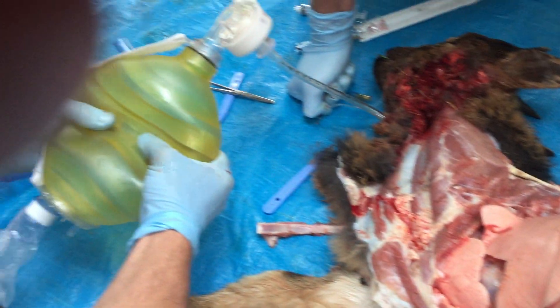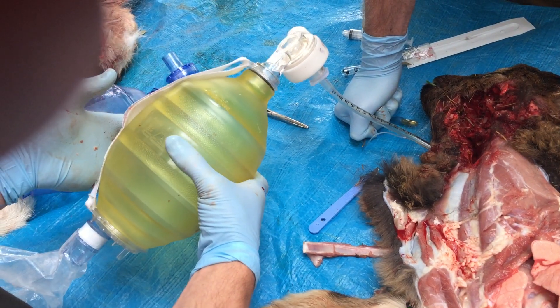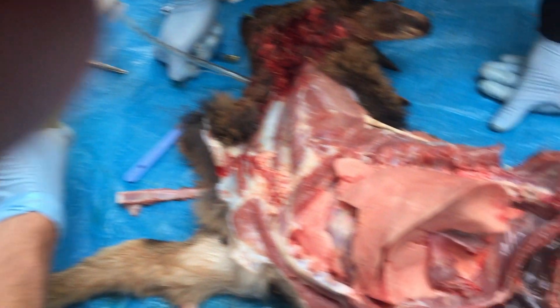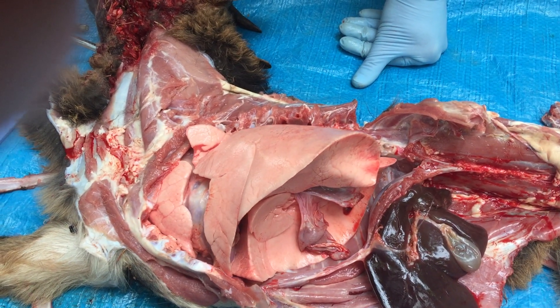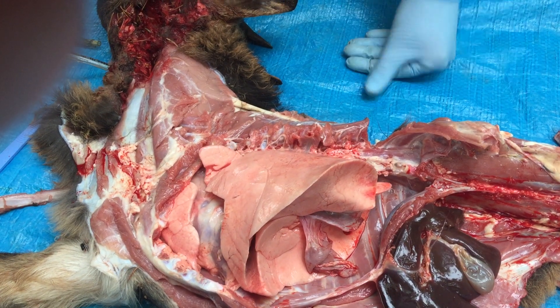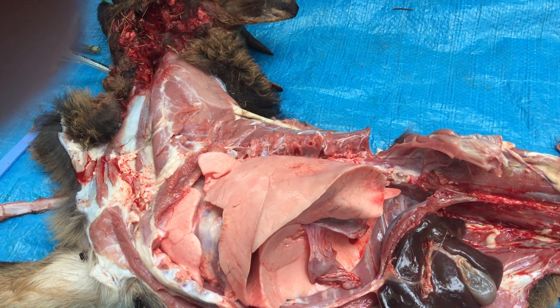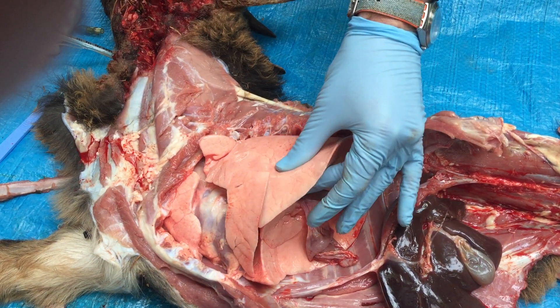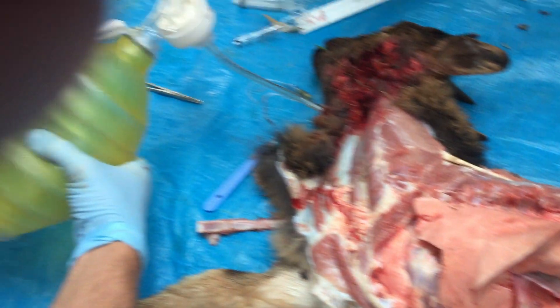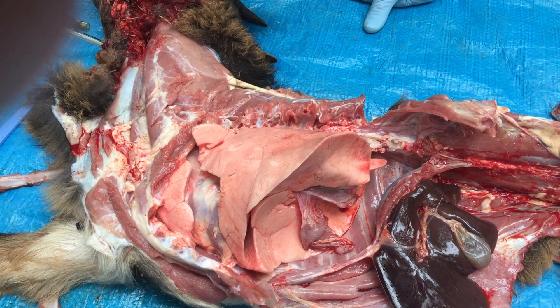So how much are you inflating there, Callum? Quite a lot. So would we call this normo ventilation at this stage? Probably not. Normo would probably be even less for this size. What would a goat weigh? You'd only need like 200 mils probably of ventilation — so it's only about ten percent of this bag.